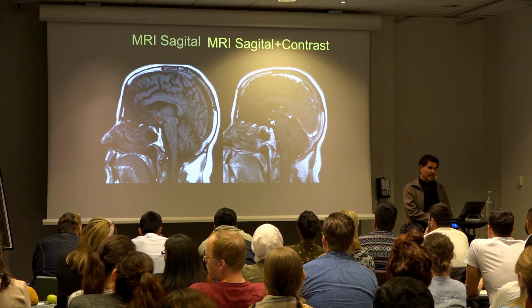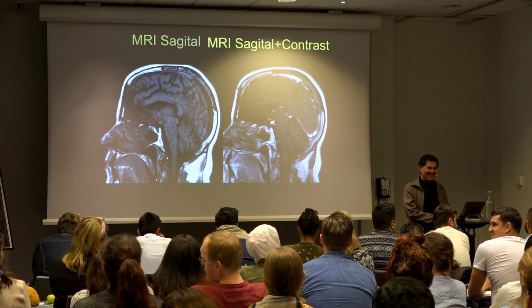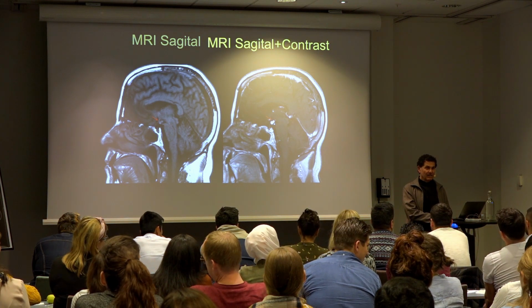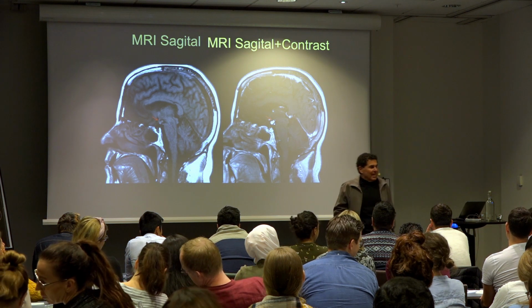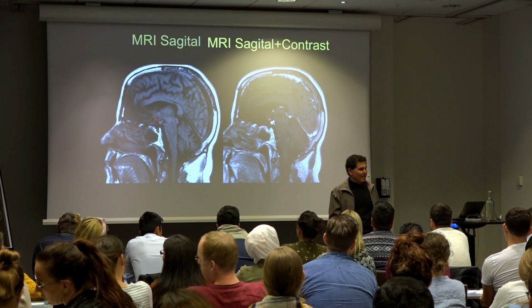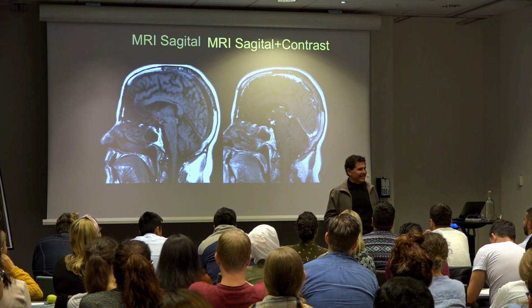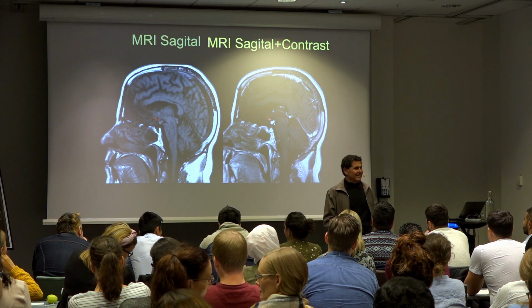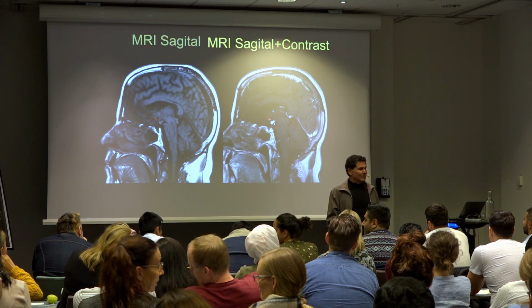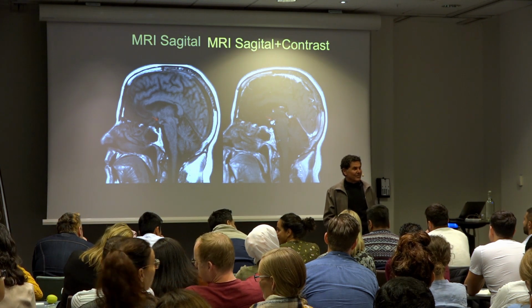It's very subtle. Yeah, subtle and scary. Well, that's what I'm saying. The point is that sometimes, as good of ophthalmologists and neuro-ophthalmologists as we are, we take whatever we can to get information to put it together to help. I'm not saying we're totally reliant on OCT, but it's a piece of information that you can easily get and use.